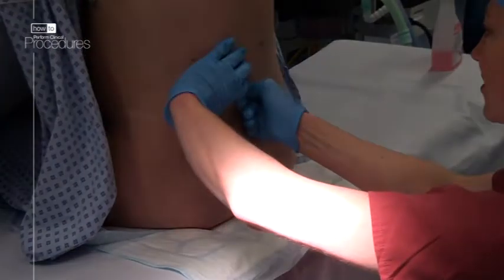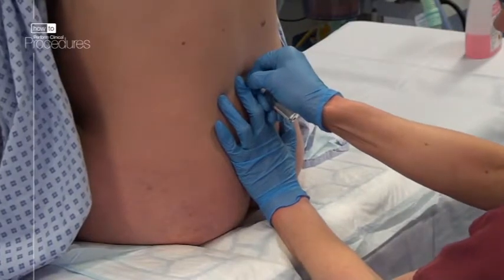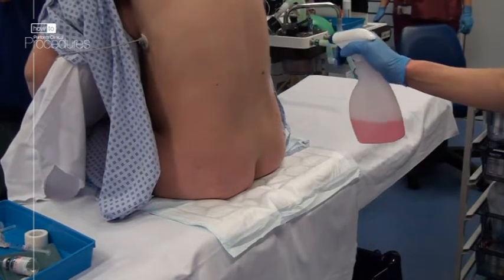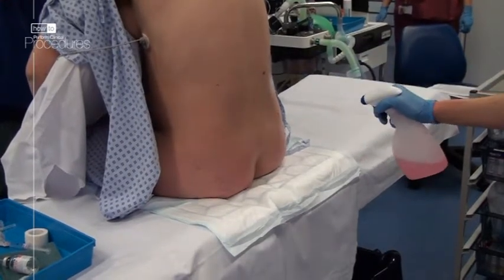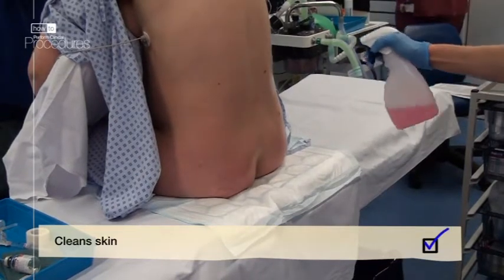You can temporarily mark this, for example by indenting the skin as shown here. Apply skin preparation — this is 0.5% chlorhexidine and alcohol, but use whatever your local policy states.